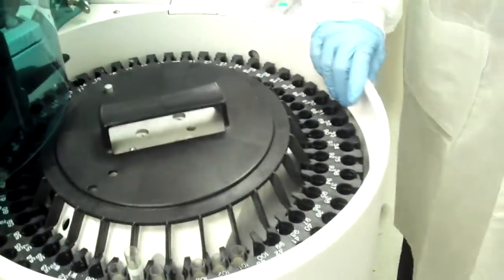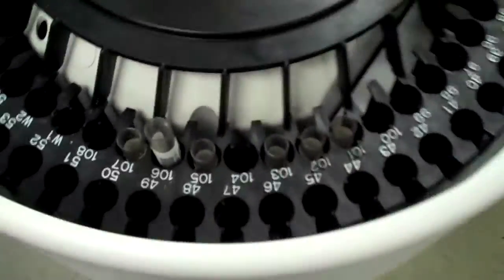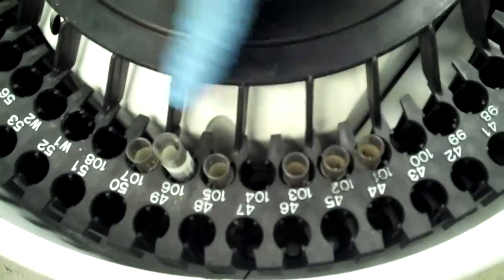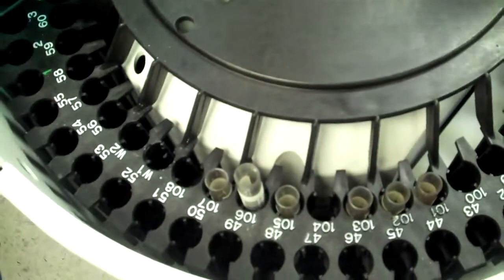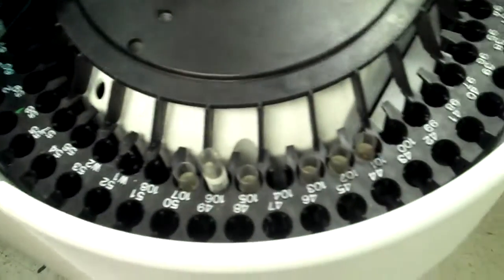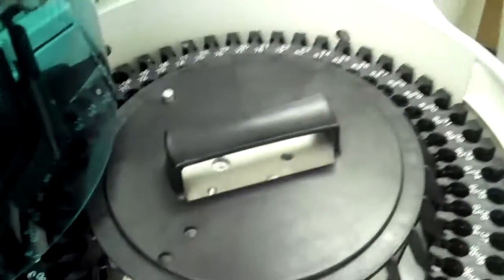So 101 through 108? Yeah, on this particular one, 101 through 108 is our stat positions, and as you can see, that's pretty much the ones we use over and over and over. Yeah. Because we don't have huge batches and runs of work coming in like a bigger lab would.